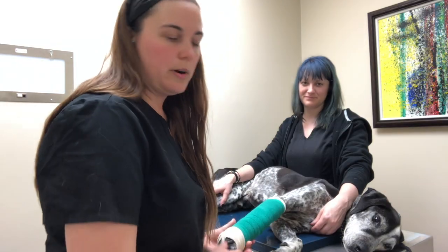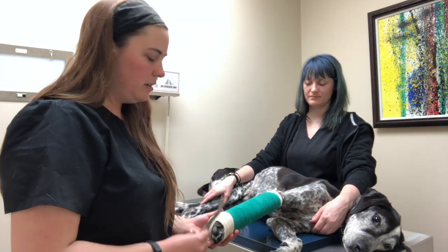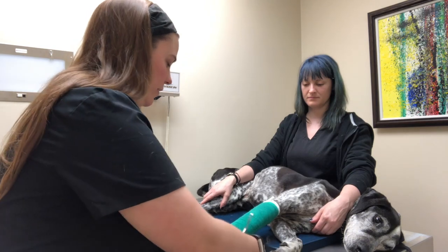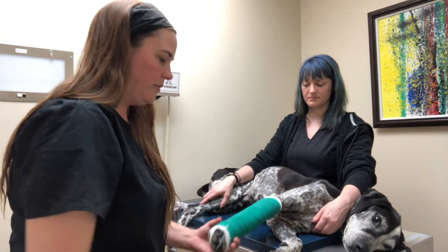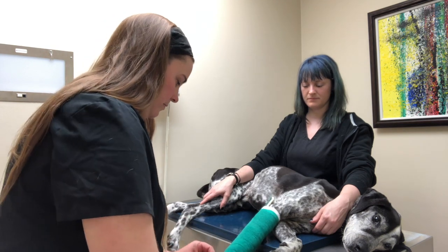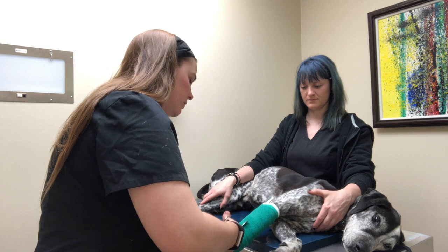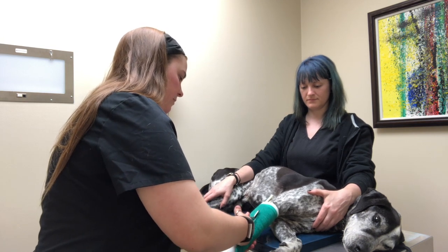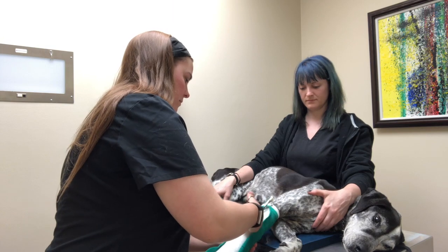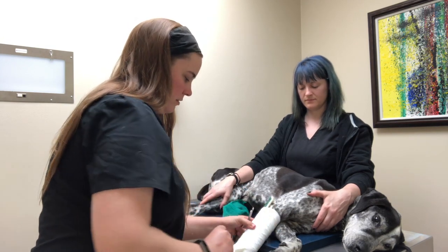So to remove our Robert Jones modified bandage, we want to do it layer by layer. So we're going to start with our first layer, our outer vet wrap. And if we can remove our tape. Stick our stirrups.